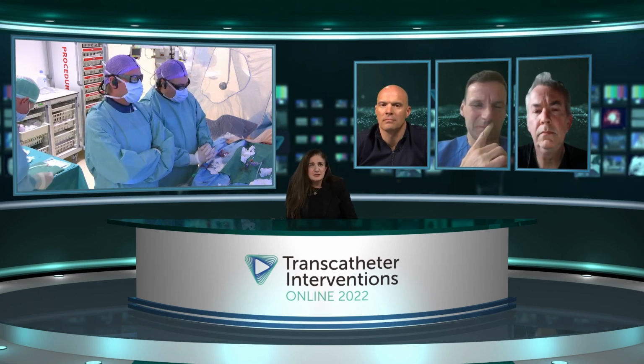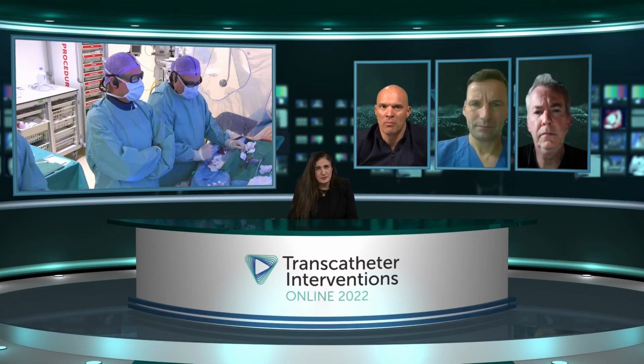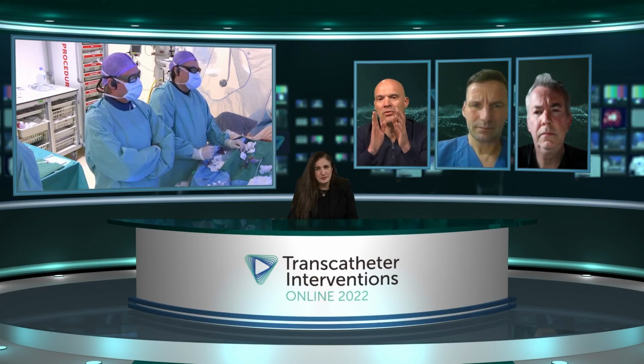Nicholas, any comments? Yeah, so this, of course, obviously is the team in Erasmus, so I know their mindset. But I would agree with David. I also would want to learn more about the ostium of the circ and the left main.